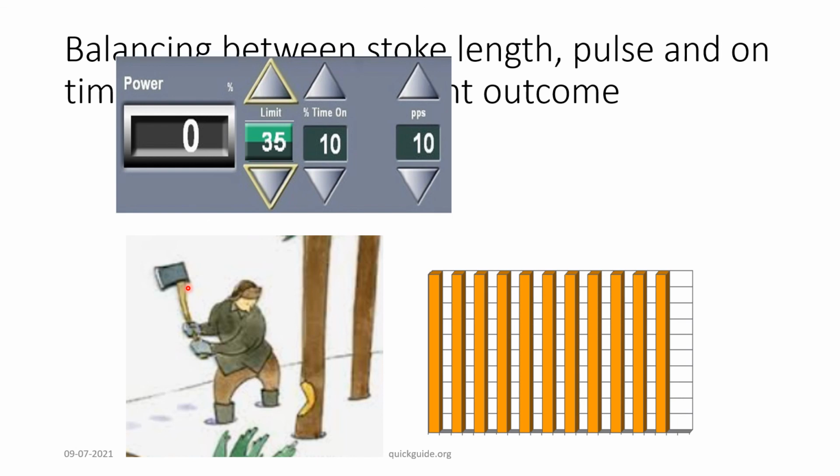If you deliver less power inside the eye, but you take a long time and there's a lot of irrigation and aspiration going on and on, a lot of fluid used, then it doesn't help. So there has to be a healthy balance between the phaco energy delivered inside the eye and the least amount of fluid also used for the least amount of time.